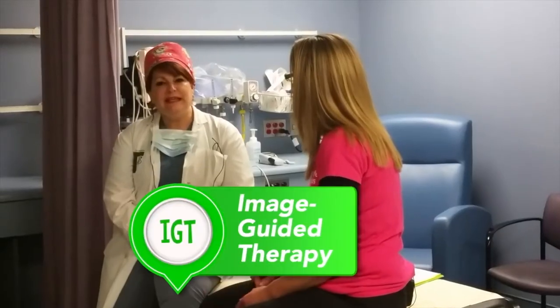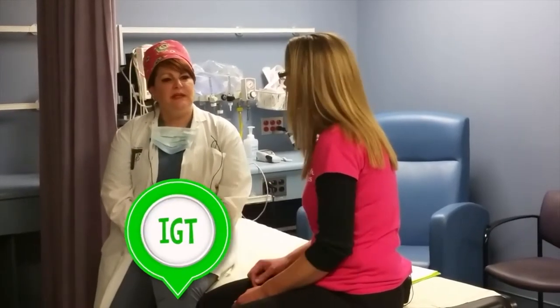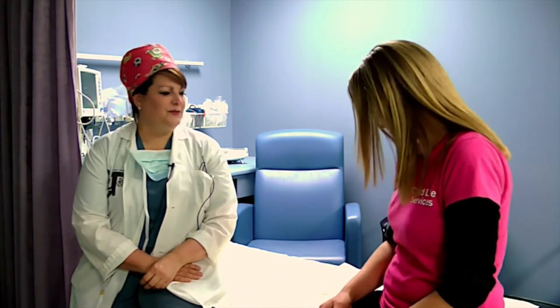Certainly. I'm a nurse that works in IGT that's had special training as an interventional radiology clinician, which means I can insert the PICC lines. Well, then you're a perfect person to talk to, because today we're learning all about PICC lines. So what does IGT mean? IGT is image-guided therapy, which means we use special ultrasound, x-ray, CT guidance to help with the procedures we do here in IGT. Oh, that sounds really neat. I can't wait to see the equipment when we go into the room. I'll take you in the room and show it to you. And what is a PICC line?